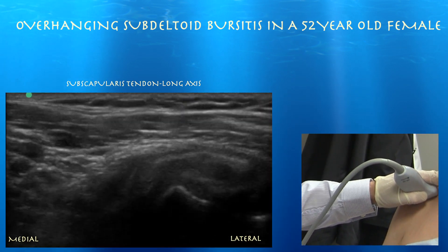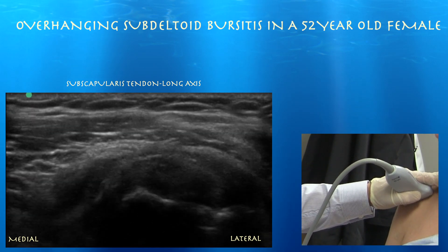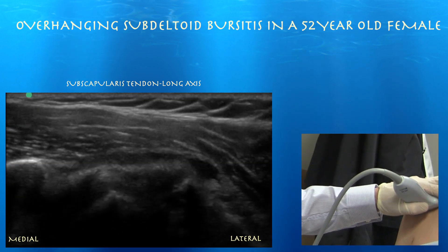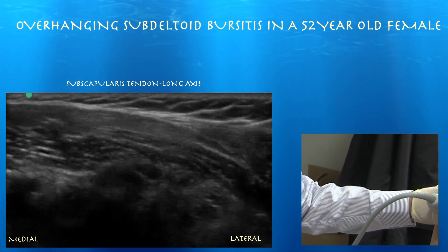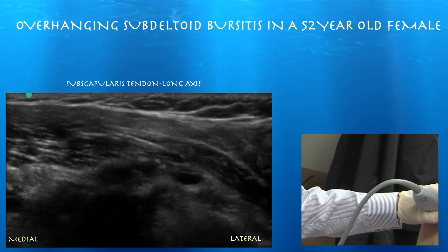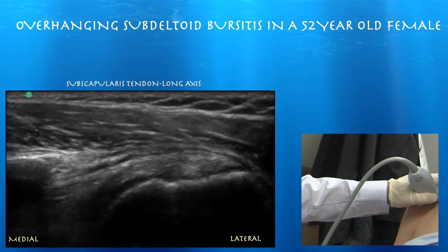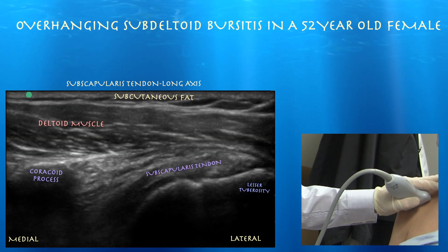Now looking at our subscapularis tendon in long axis. The subscapularis tendon looks essentially normal. But what we did find was this overhanging subdeltoid bursa, which shows some fluid as we go towards the inferior part of the subscapularis tendon. Moving medially now — the left side of the screen is medial. We can see the coracoid process, and there's the coracoid with the subscapularis tendon as well.